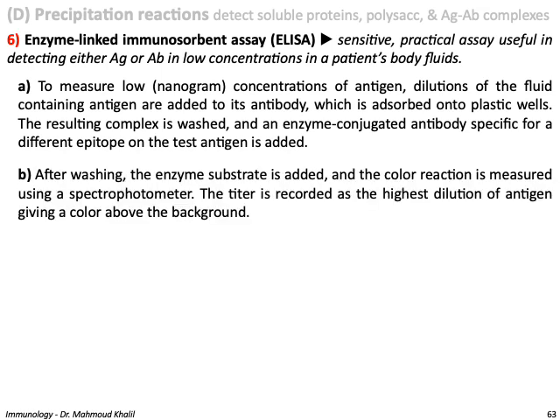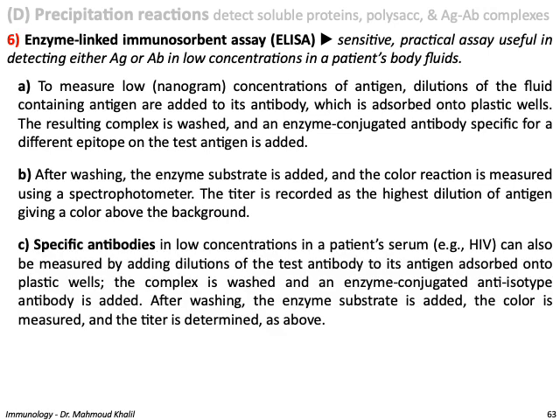After washing, the enzyme substrate is added and the color reaction, which is actually the readout, is measured using a spectrophotometer, which corresponds in the last test to the radioactivity. The titer is recorded as the highest dilution of antigen giving a color above the background.